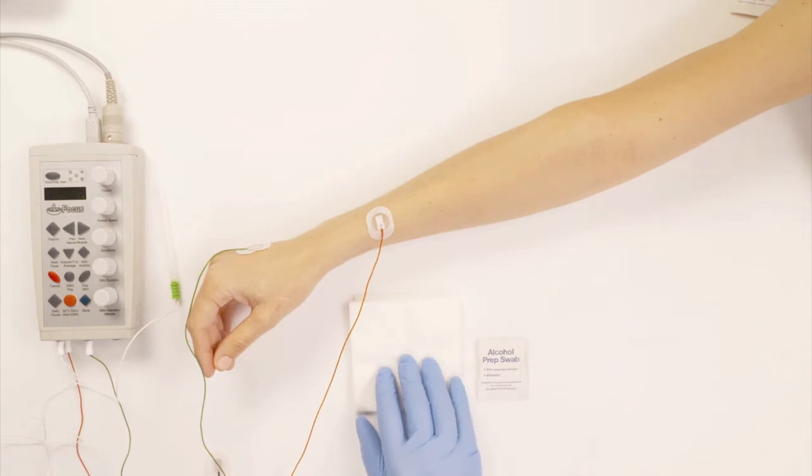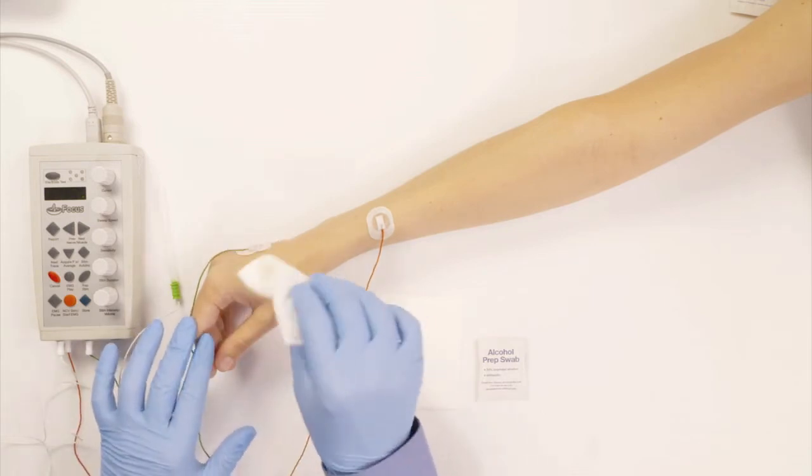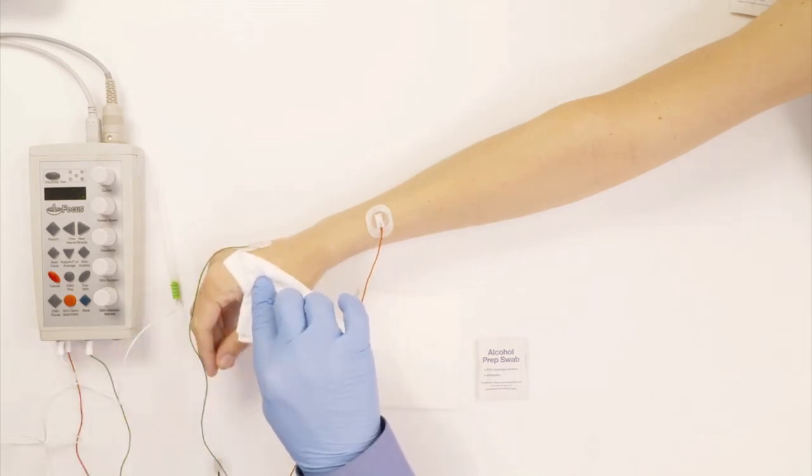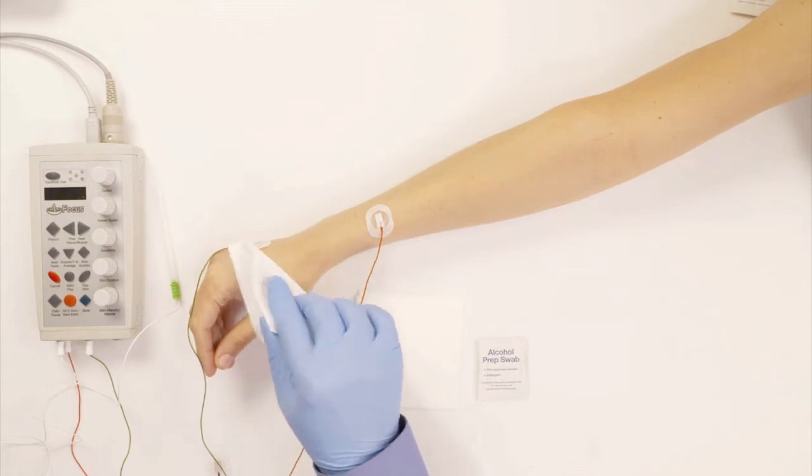And you notice that a couple of other things that I've added in the scene here, and that's a dry gauze, because if you actually encounter some bleeding, you want to press on the spot that is bleeding. You don't want to wipe it. You want to press on it for about 30 seconds until you stop the bleeding.